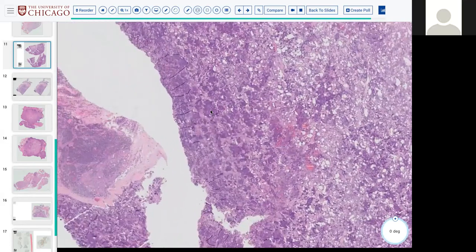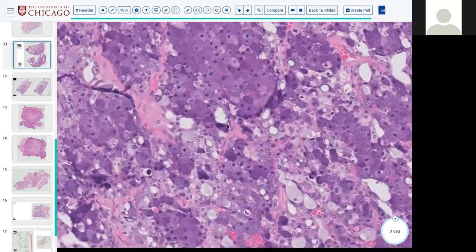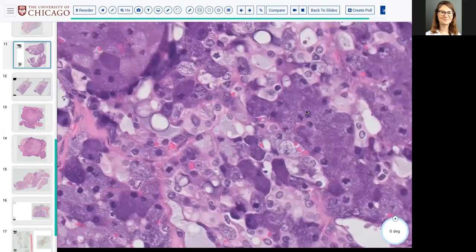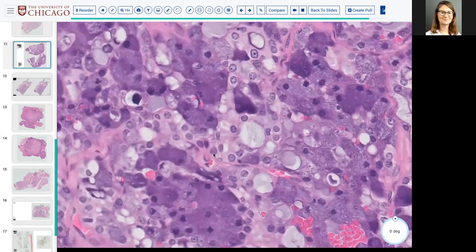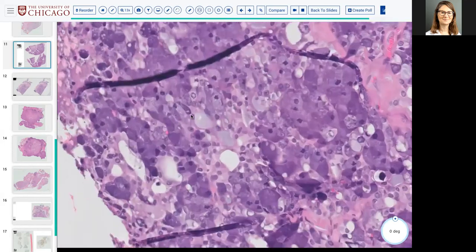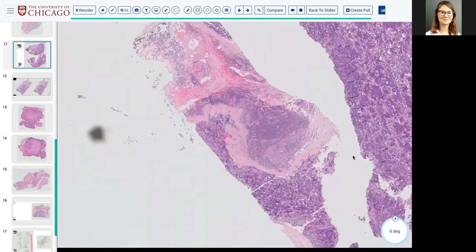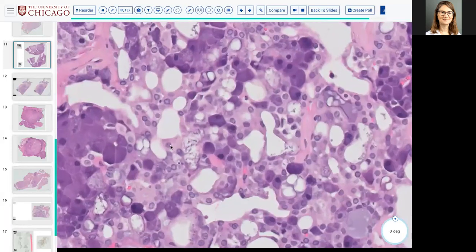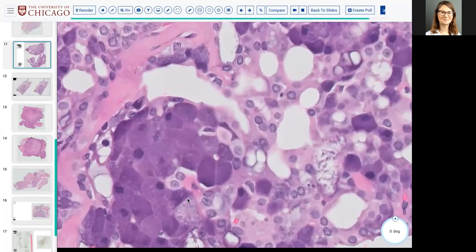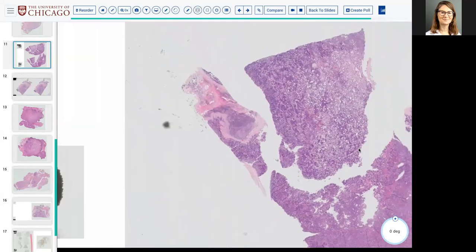Amylase. That's a good talking point. PAS definitely, but wouldn't an amylase stain be useful? The pancreatic amylases that they use in pancreatic acinar don't work as well in salivary acinic cell. I've tried them, but they're not as reliable. Just using the histochemical stain PAS diastase is going to give you more yield, because the amylases don't work as well in salivary. You'll see the nice retained, really dark, chunky granules, because they are diastase resistant. So for me, PASD is very helpful.